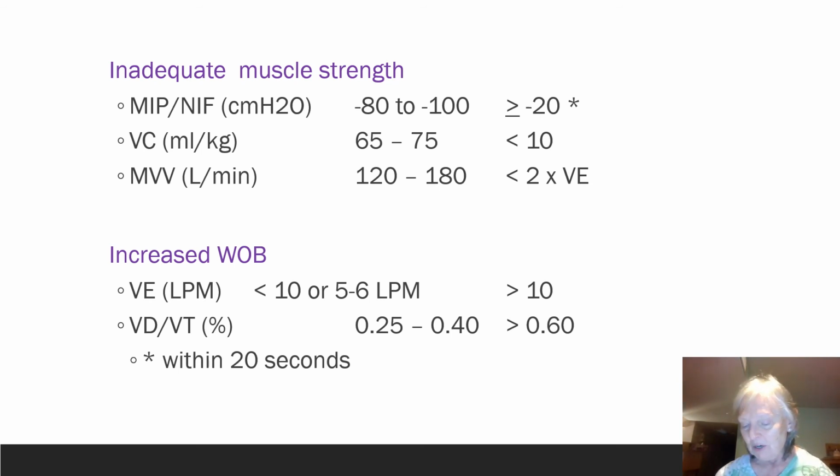One of my mentors, I was talking with him one time, and we were sort of joking about this a little bit. And he said, "Yeah, we did it one time, and the guy promptly coded on us, and had to be intubated at that particular point in time." So the MVV is something, if you can really avoid it, that's one of the things you want to do.